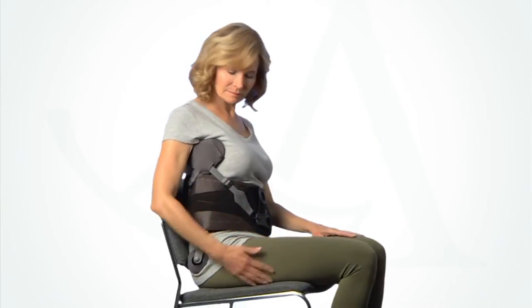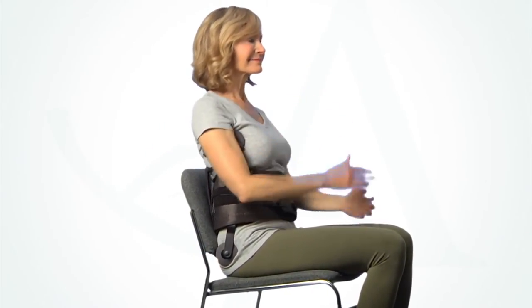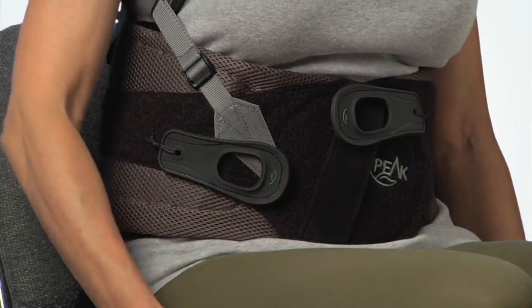When seated, check that the brace is comfortable and that the trochanter pad is not too low and that the thoracic pad is not uncomfortably high. To maintain effective, comfortable support, it can be helpful to slightly loosen the upper portions of the brace by adjusting the right pull tab.